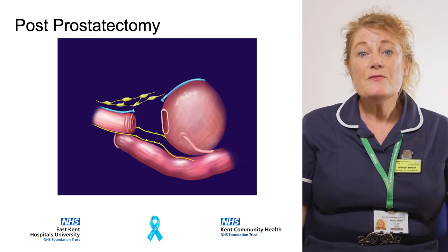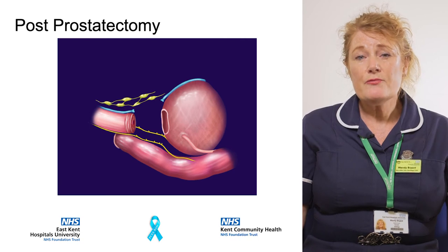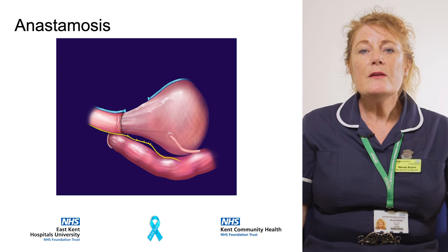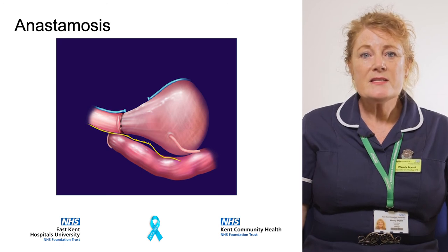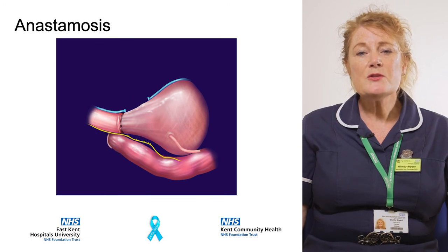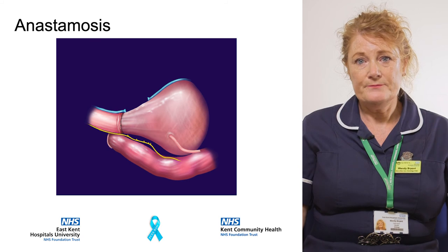Here is an image of the structures with the prostate removed. Following removal of the gland, the base of the bladder is surgically attached to the urethra. The attachment of these two structures is called the anastomosis.